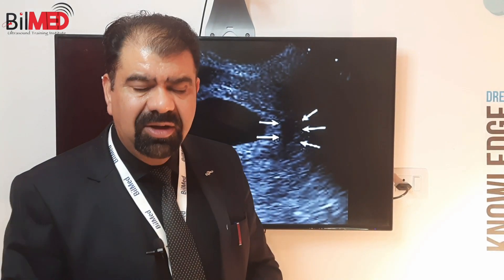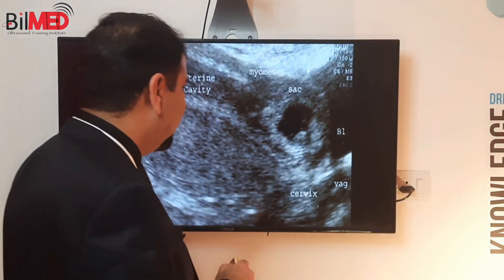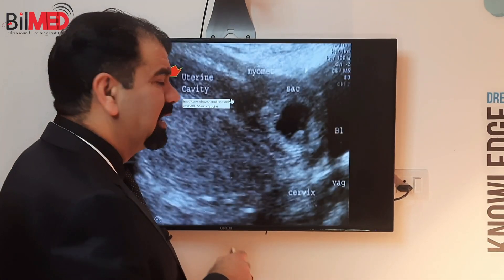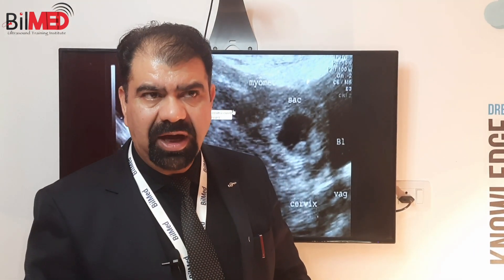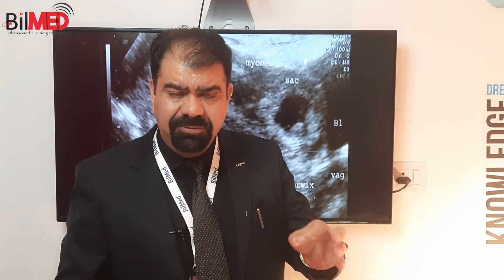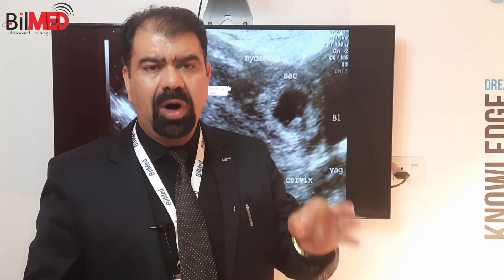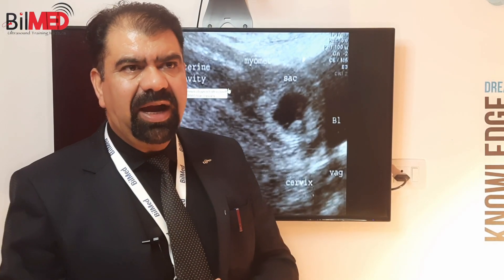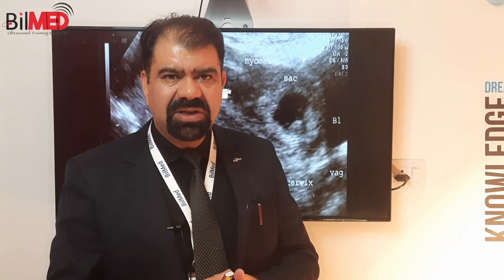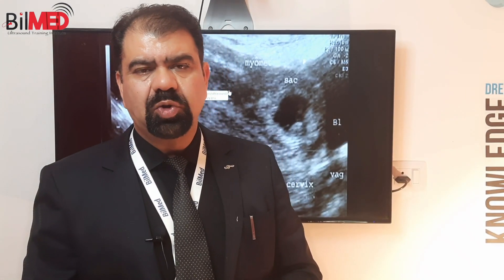Point number three: why should I know about this unobliterated uterine cavity? If we are seeing an unobliterated uterine cavity, ectopic pregnancy is ruled out. In a pseudo sac there will be no unobliterated uterine cavity. So these are the important points and this is the basic definition of what the DDS actually is.